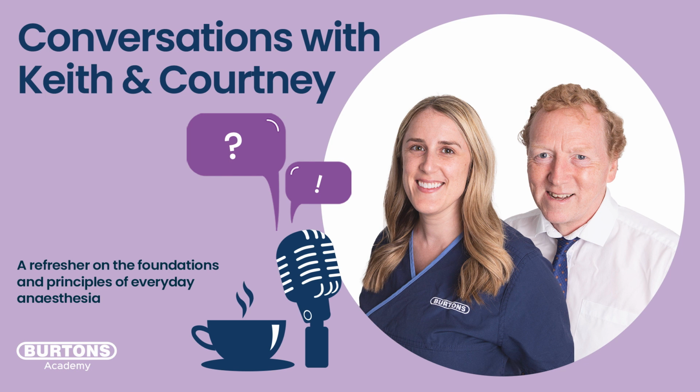You've got a tidal volume of 70 mils, and every breath is the same. Then you lean on the chest or you restrict it somehow. You ventilate to the same pressure, but the volume drops to 55 mils, because that's the change in compliance, and that's the effect of changing compliance on a pressure cycle ventilator. But the nice thing is that nothing happened to the pressure. The pressure did not go above what you set.